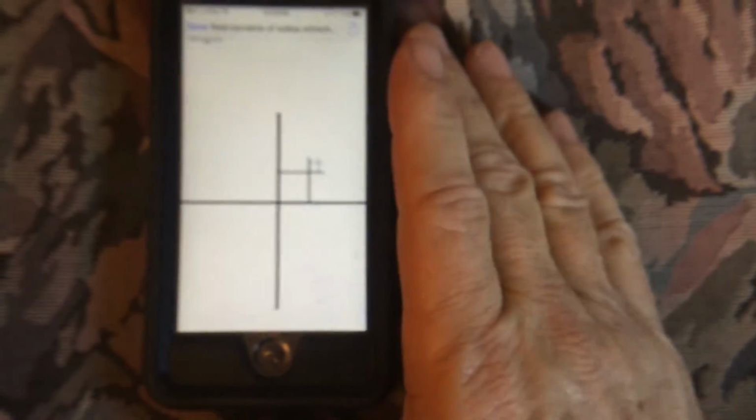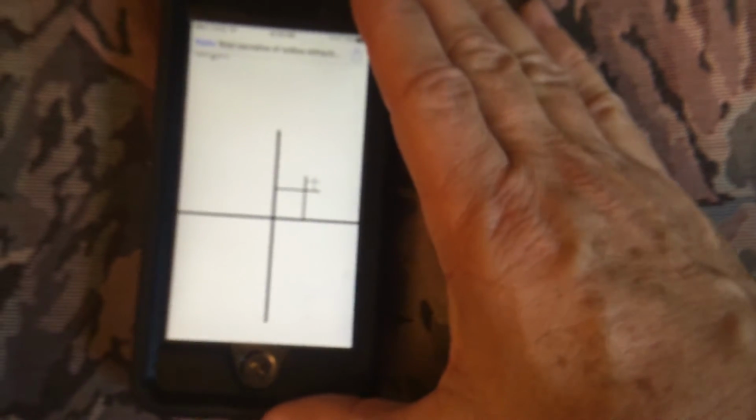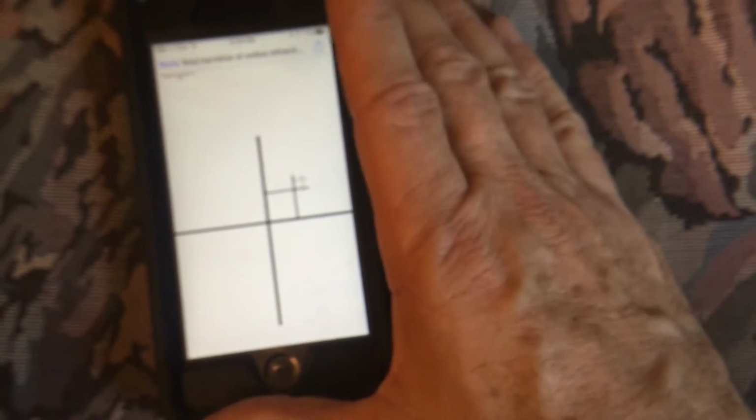you're going to define that you have farsightedness by noticing that the image stays fairly out of focus if you move closer or further. And now at your standard reading distance, you're going to want to move the phone slightly 10 to 15 degrees in one direction to see if it's widening in one direction or narrowing. And it appears to be widening in either direction, which is not unusual for 2D refractive error.